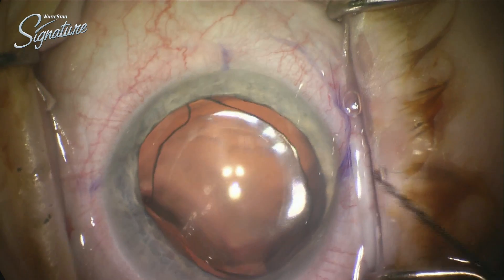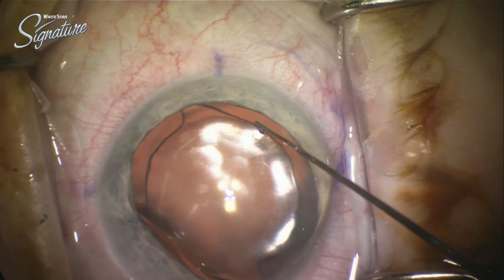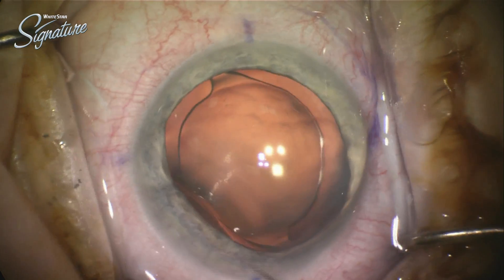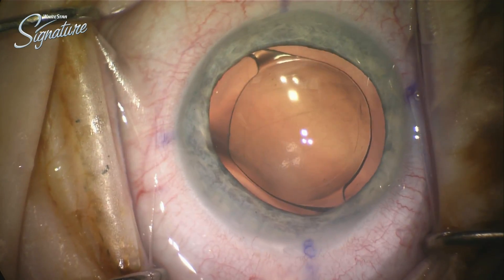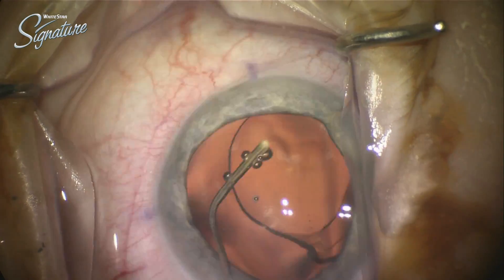So here the lens is, and I've beautifully marked the cardinal meridians, but I noticed right there at the tip of my Lester there's an interstromal mark. Now I thought those were supposed to fade, and so I was fairly surprised — pleasantly so — to see that toric alignment mark, because I had confirmed that that was the position I wanted in the office at the slit lamp.